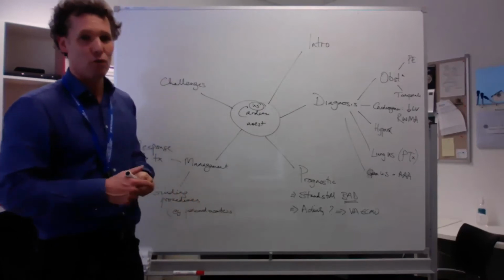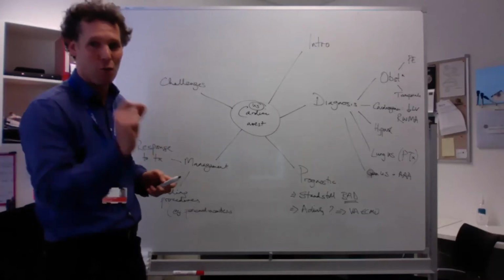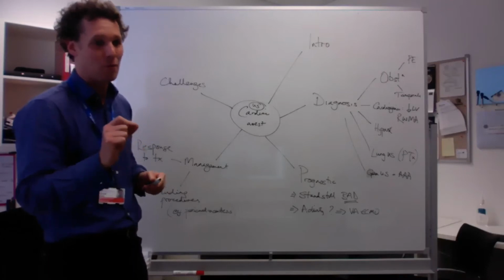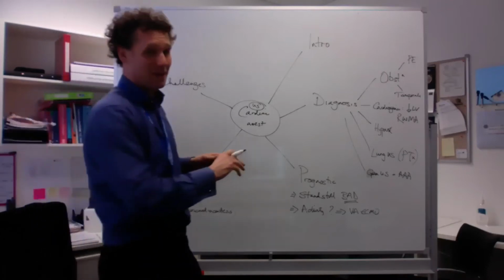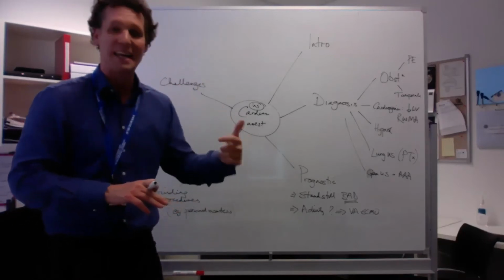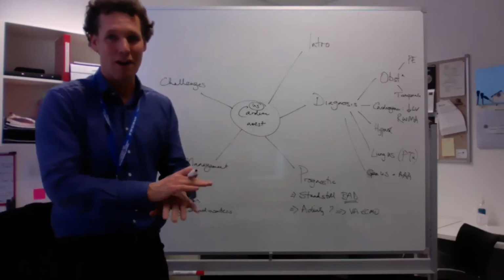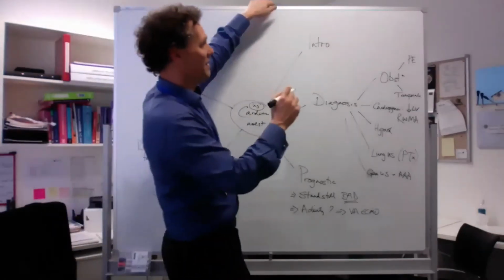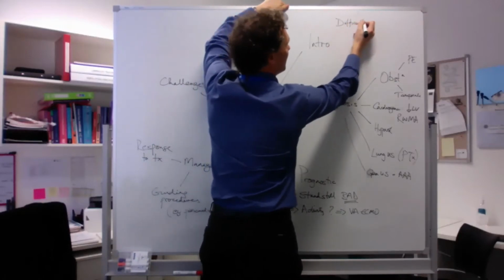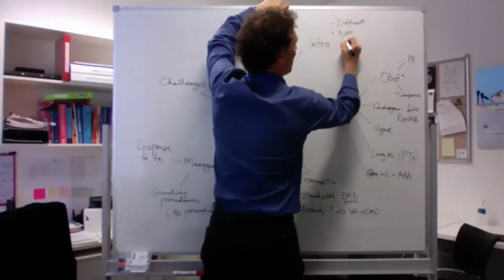The first of all would say that it is not the focus of what is going on at that stage. Putting that echo probe on is an important part, but it's not in the recommendations of the major guidelines. They say it can be used, but the most important thing is that someone's doing CPR, right? So I would say in the intro, it's difficult. It should not stop CPR.